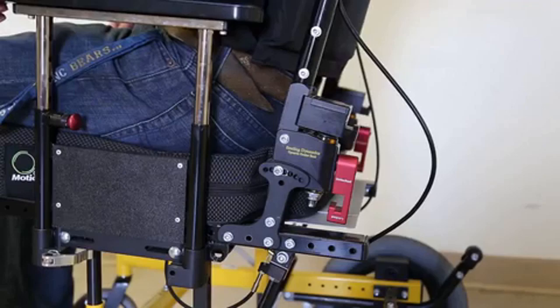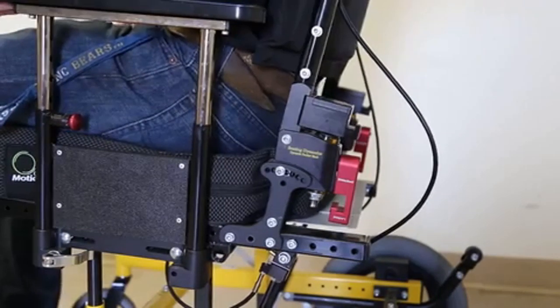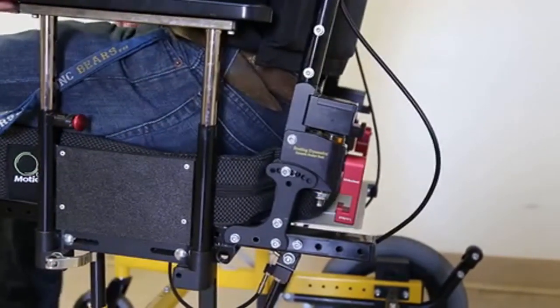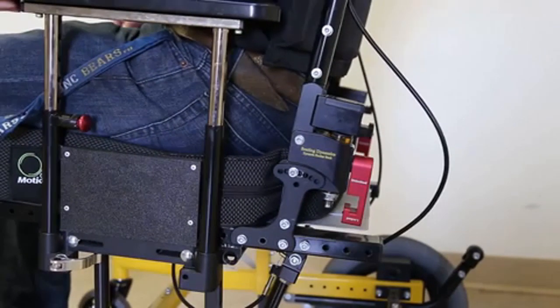So we're going to watch a video of this. You can see that movement, and that movement is right at that little polymer there, or elastomer, that's providing the movement of the back.